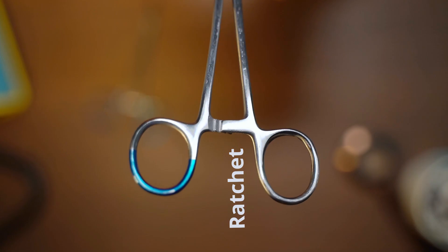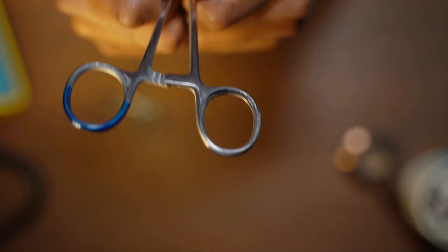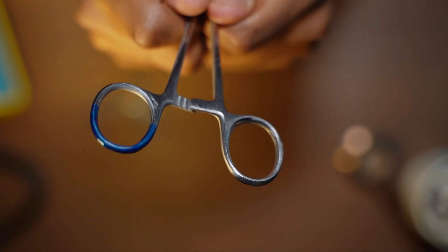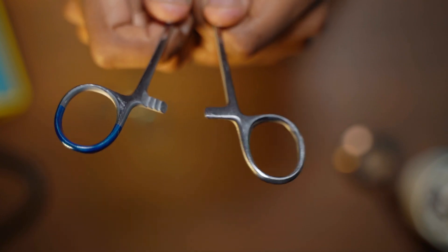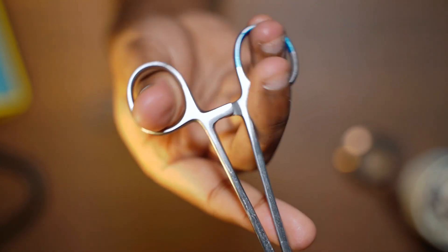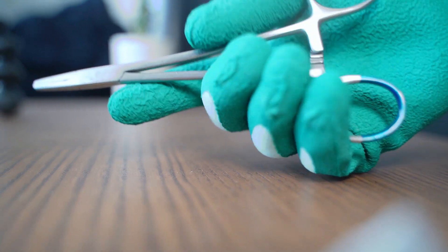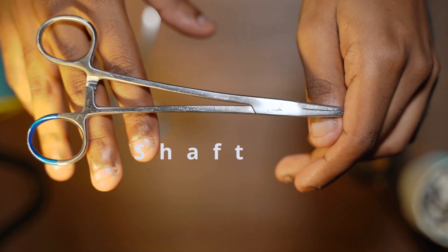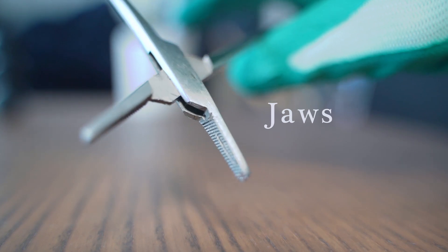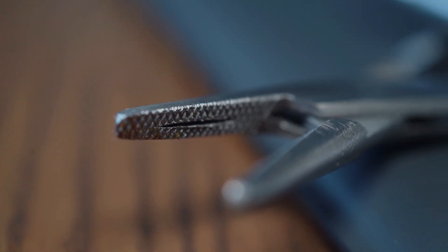Those two are the rings, and we can see the actual locking mechanism which is the ratchet. In between the two rings you can see there are these three sawtooth shaped edges on both sides, and these actually hook together to make that satisfying click. You've got the rings, you've got the ratchet, and then you've got the shaft which is the length of the body itself. The end of the needle holder has jaws, and inside the jaws there are crosshatched serrations — that's what's used to make sure it has a grip on the needle.